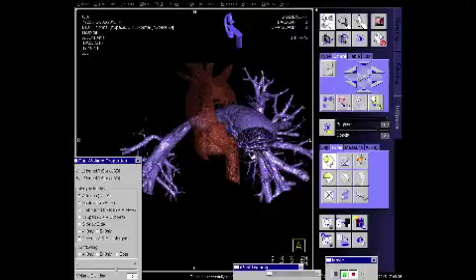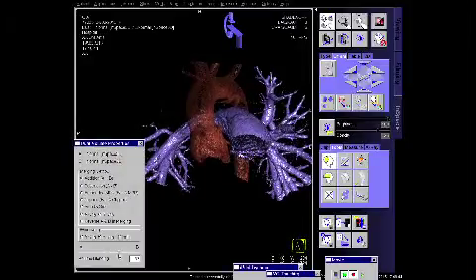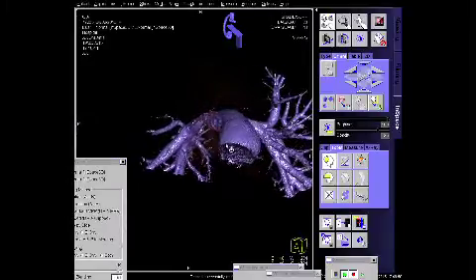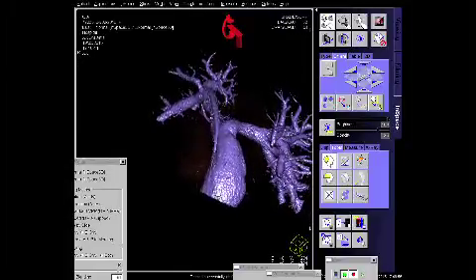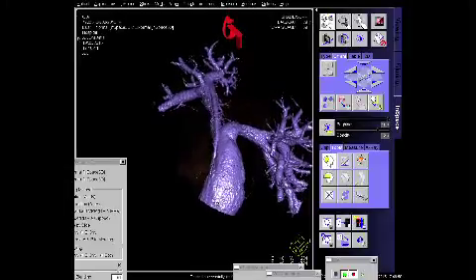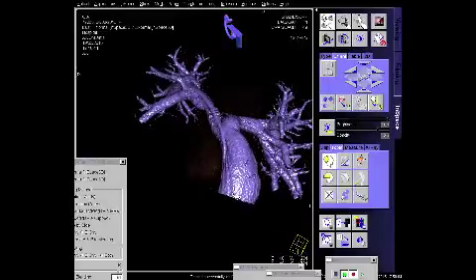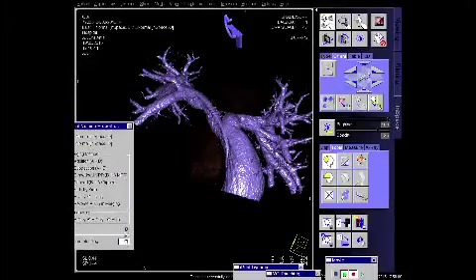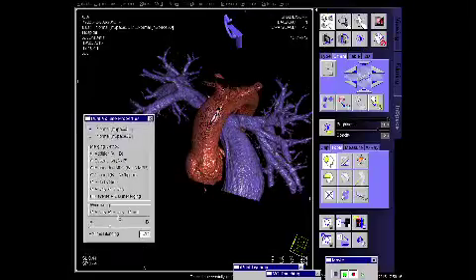If we take a look at the angulations Mirella will show us, we see in blue the pulmonary artery. We cut away the RVOT, right ventricle, which is a pretty big RVOT. We did the left ventricular injection to show the coronary situation. The coronary, especially the left, is pretty far away from our region of interest where they put the stents in. It's just facing the dorsal part of the PA trunk, so no problem from the aortic side. In this image, you can see collaterals at the aortic part, which are of course not important, but they show details of something like 0.3 millimeters. So what we see is real and high detail, with high spatial resolution.